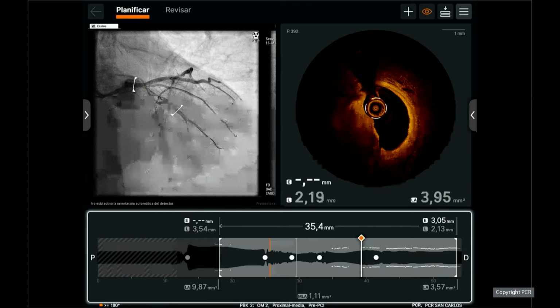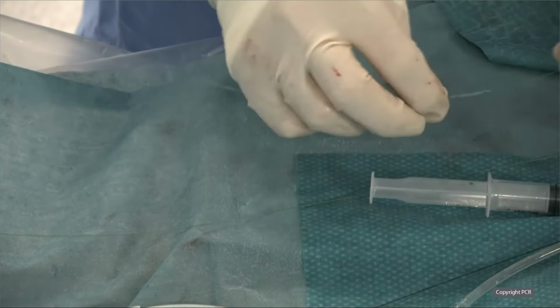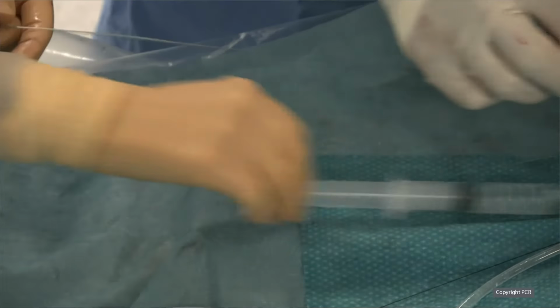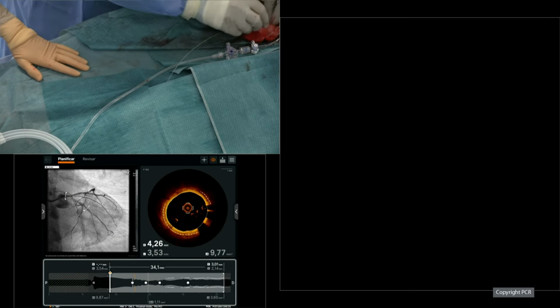This is a small trick for interventionalists in the room, more than 50 years old. You focus on my hands. You can see how I managed to put a wire. Can you focus on my hands? This is how I put wires into my balloons. I just use half of the syringe to put the wire directly in. So it's a trick balloon. Not for seniors, so not for fellows, but for seniors. We have a set of teaching points for fellows and for the next generation, meaning next gen, people that are like me.